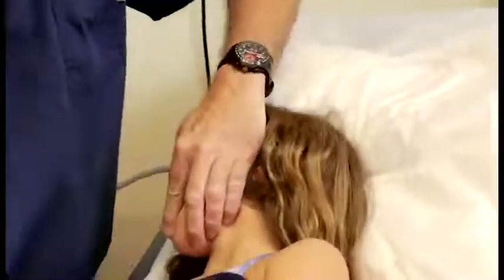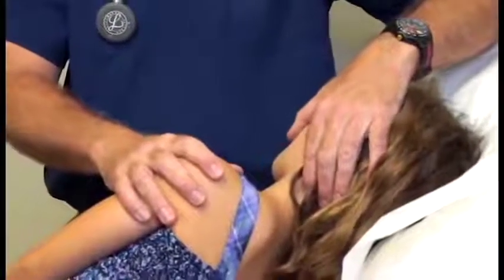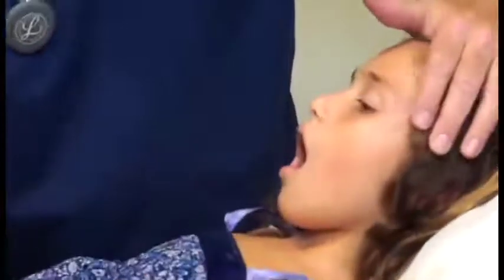Look for a result — did it work? Immediately roll the person on their side. Is there a foreign body lying in her mouth that if she takes a gasping breath is going to go flying back into her airway? Is she going to throw up? If she's breathing, leave her on her side and let her catch her breath. If not, roll her back and repeat.